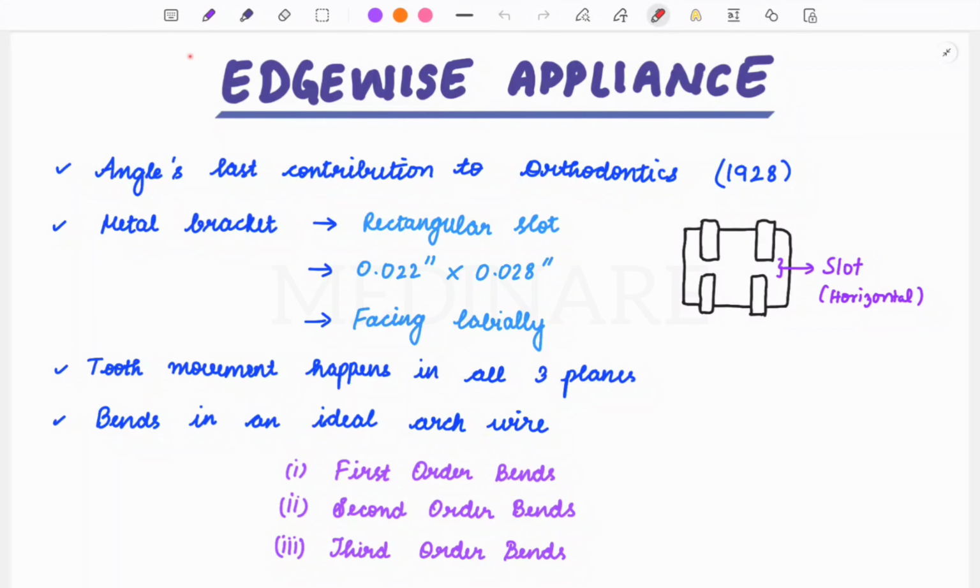Welcome back to Medinare. In this video, let's discuss first, second and third order bends in orthodontics.